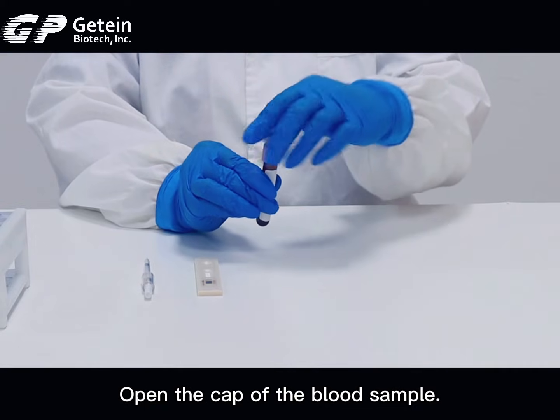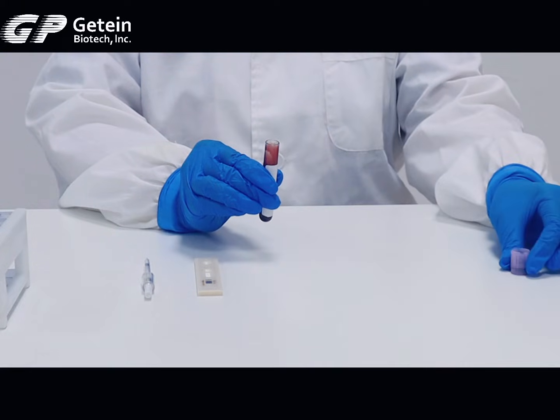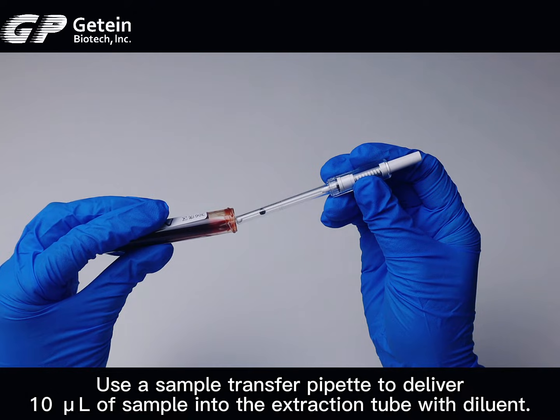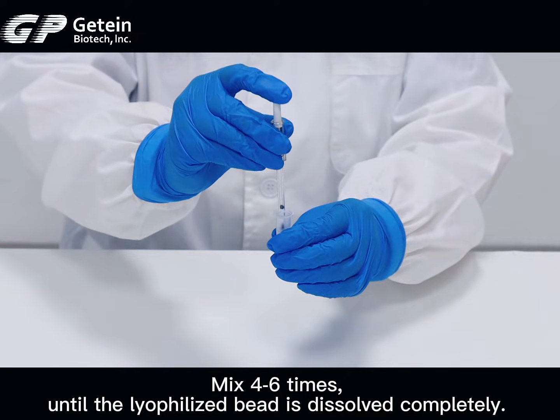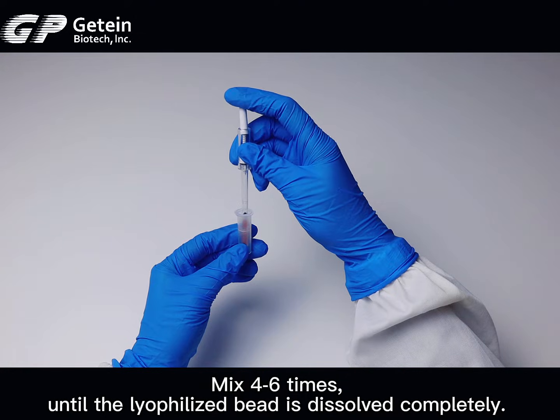Open the cap of the blood sample. Use a sample transfer pipette to deliver 10 µL of sample into the extraction tube with diluent. Mix 4 to 6 times until the lyophilized bead is dissolved completely.